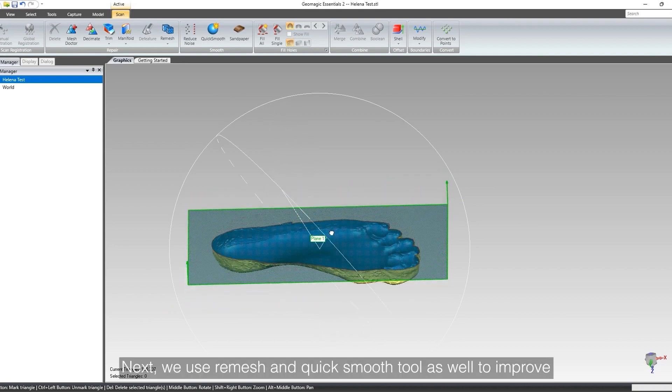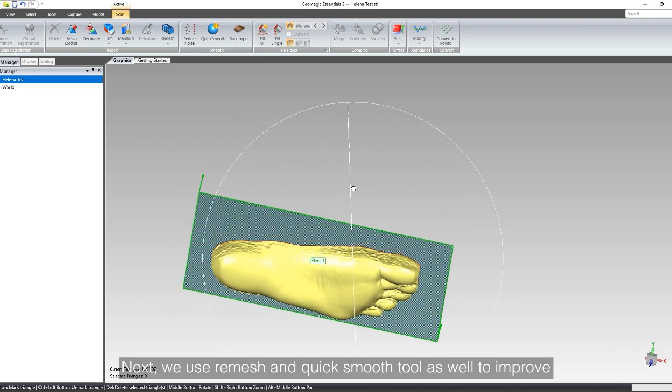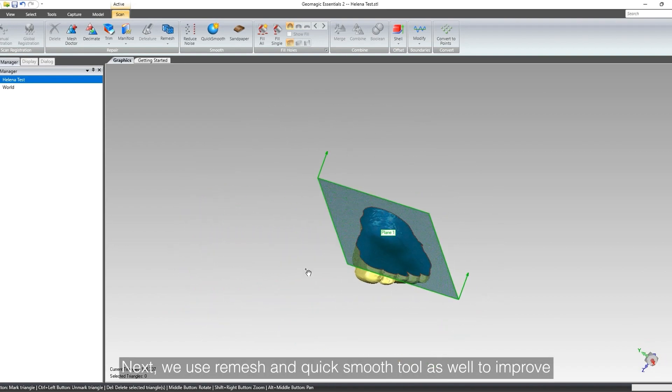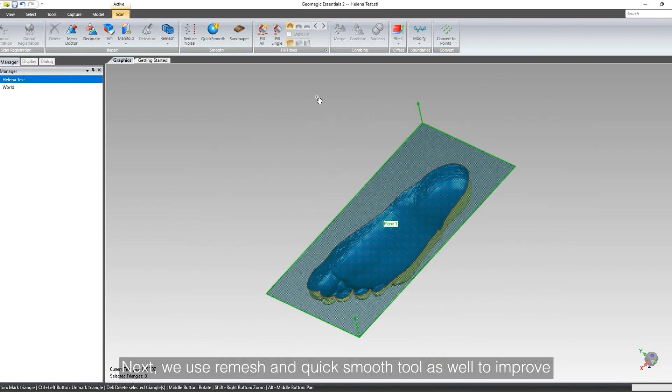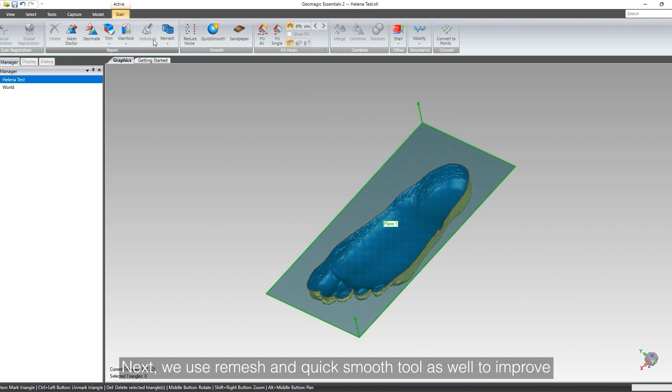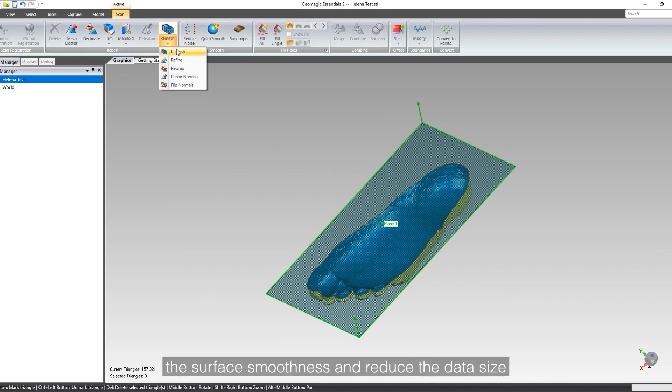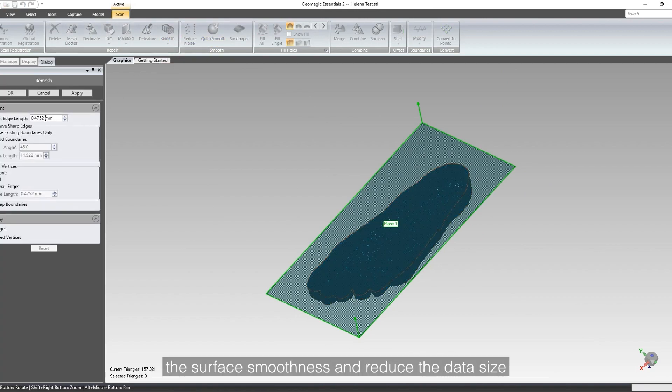Next, we use remesh and quick smooth tool as well to improve the surface smoothness and reduce the data size.